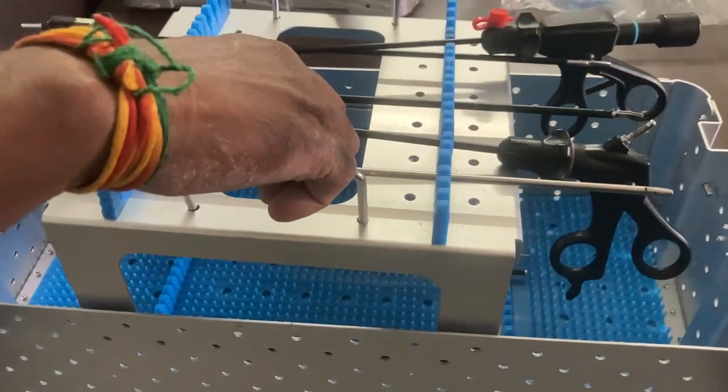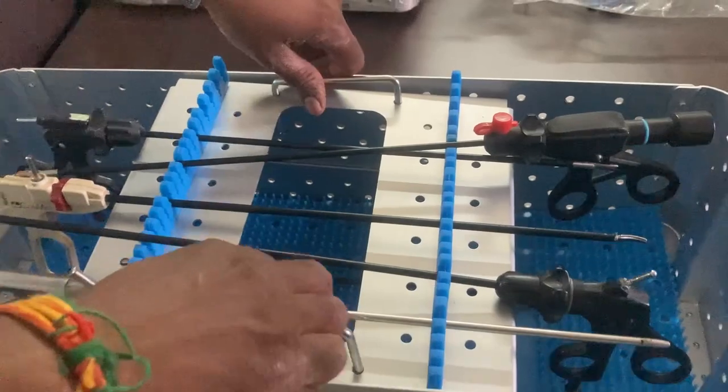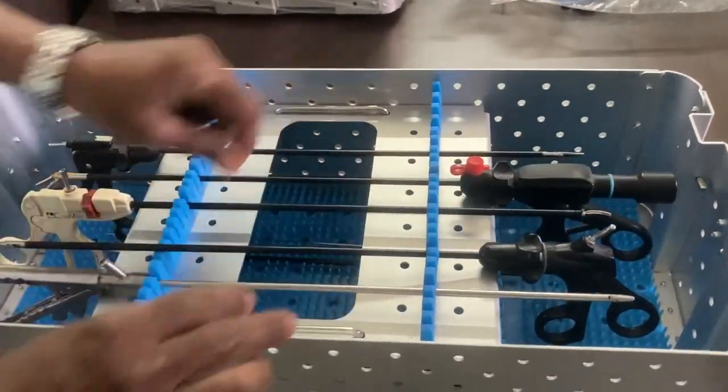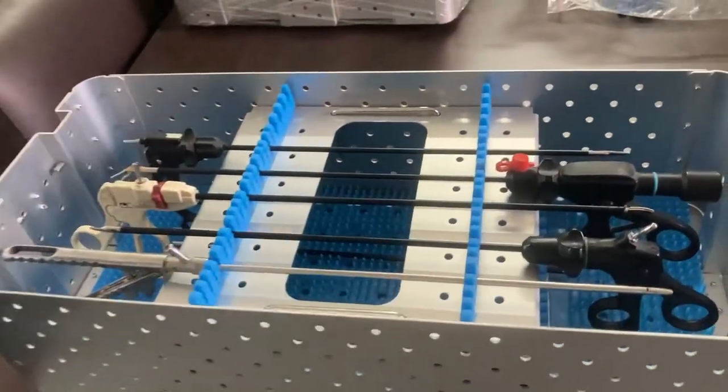It is easily removable and washable, and you can do all types of sterilization — steam, ETO, and plasma sterilization.